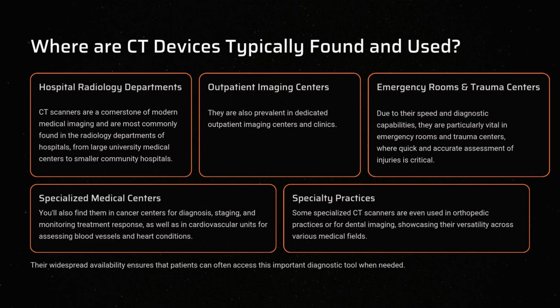Due to their speed and diagnostic capabilities, they are particularly vital in emergency rooms and trauma centers, where quick and accurate assessment of injuries is critical. You'll also find them in cancer centers for diagnosis, staging, and monitoring treatment response, as well as in cardiovascular units for assessing blood vessels and heart conditions. Some specialized CT scanners are even used in orthopedic practices or for dental imaging, showcasing their versatility across various medical fields. Their widespread availability ensures that patients can often access this important diagnostic tool when needed.